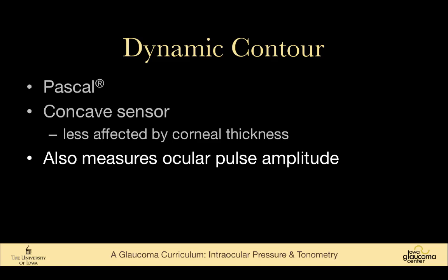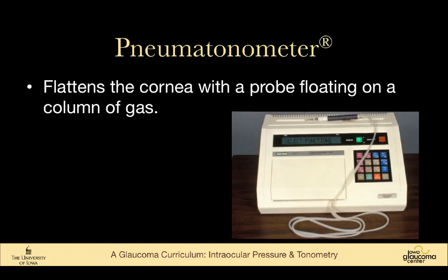We know that we want to lower their intraocular pressure by 30%, measured with the Goldmann tonometry. So I think it is important to know the precise intraocular pressure, but it's less important for day-to-day clinical care of an individual patient than knowing their relative pressure compared to when they were being damaged.